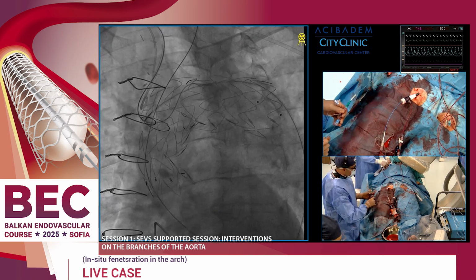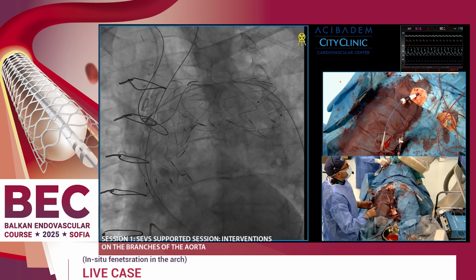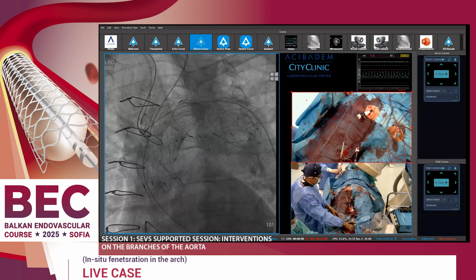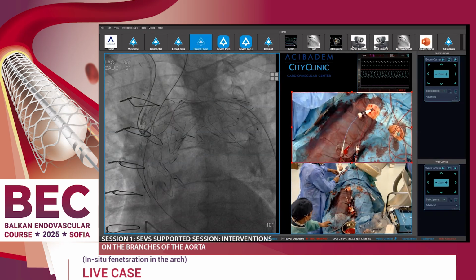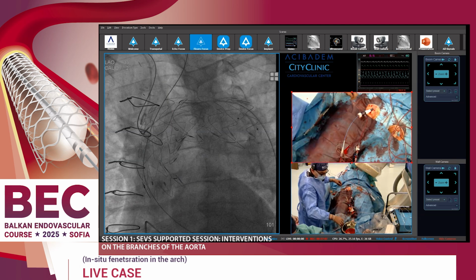6 is perfect. We have here the right Judkins. Everything is good.